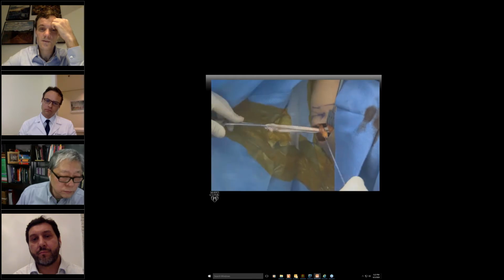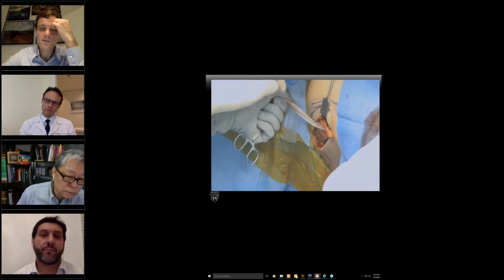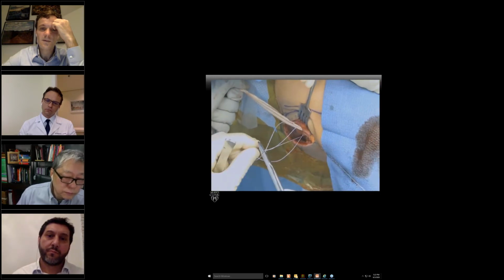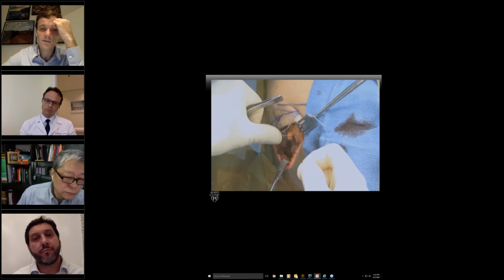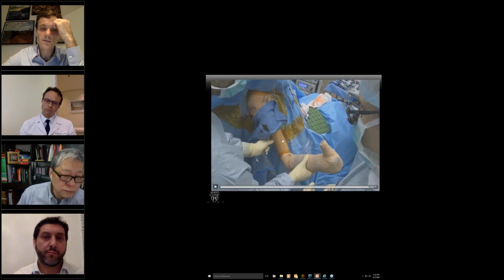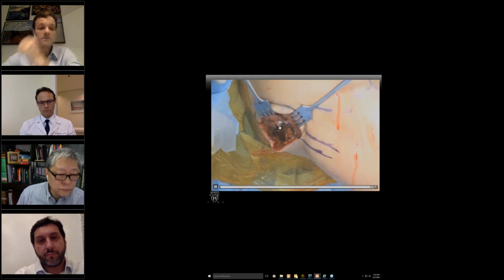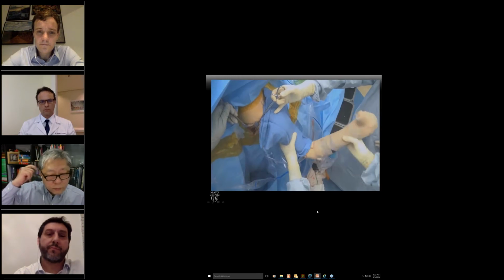You can flip it as almost a Pulvertaft. You can pull on both sides, the way you want, but I like to go inside the tendon and make it pull. Either pulling it on both sides as you're keeping the shoulder in abduction, external rotation, or I flip it in itself and do a Pulvertaft. The key is you need to have a nice, strong repair. And then as you notice, I took it from abduction, external rotation to adduction, external rotation at the end, because this will tension the graft very well. And with some motion, you can see very nice motion going in internal, external rotation of the lower trap.